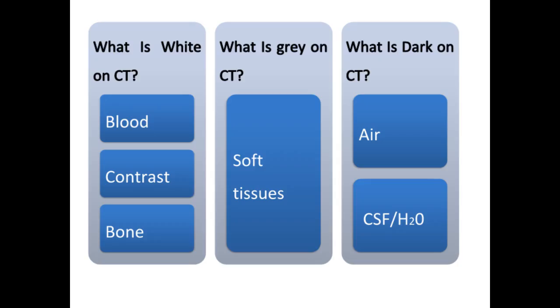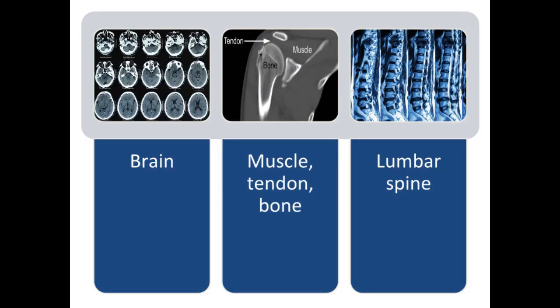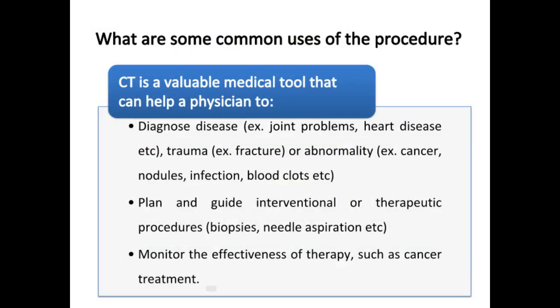On a CT scan, blood, contrast material, and bone appear bright. Soft tissues appear gray, and air and CSF or water appear dark. These are some images of different parts of the body showing CT scan results.